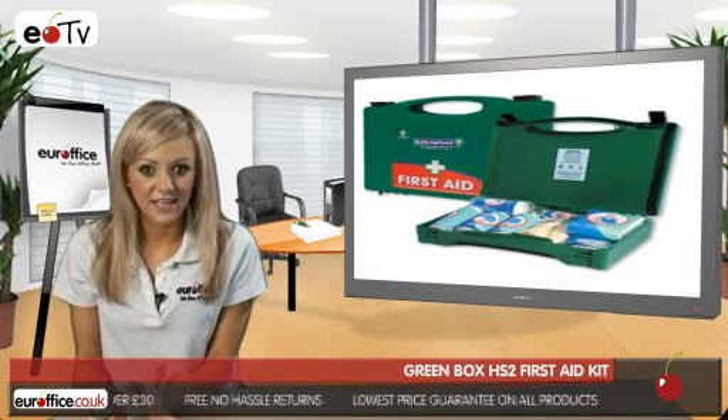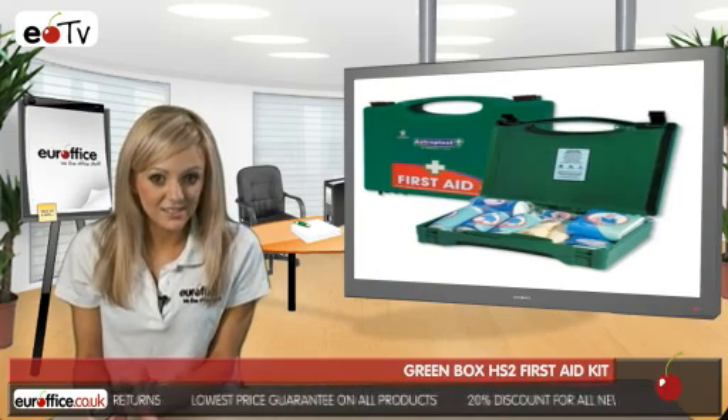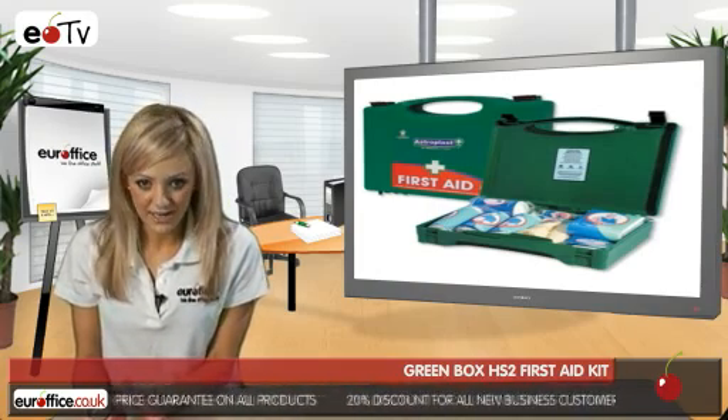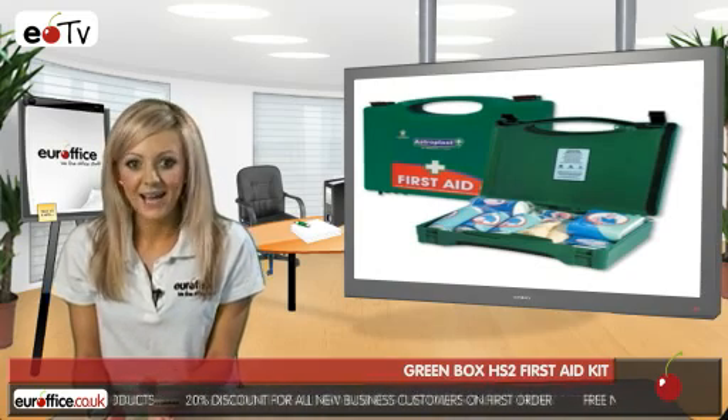Once you're happy you're doing the right thing, you can make use of the Green Box First Aid Kit's 40 plasters, 12 sterile dressings, and six triangular bandages, as well as the included wipes, disposable gloves, and safety pins.